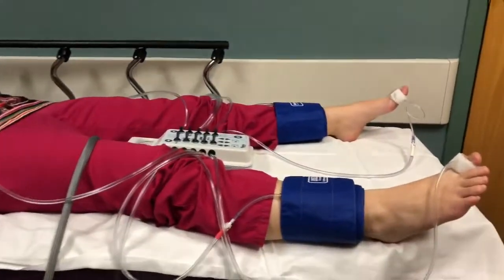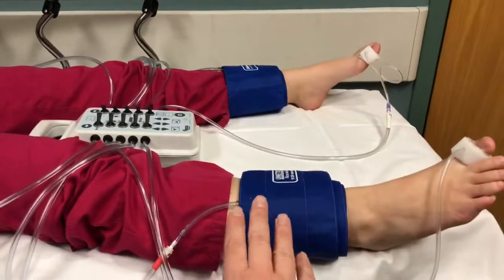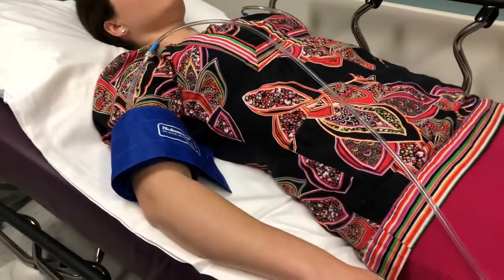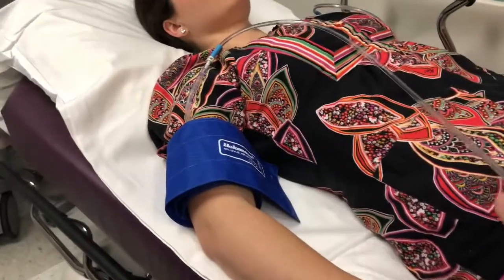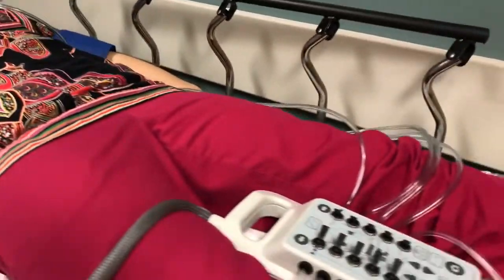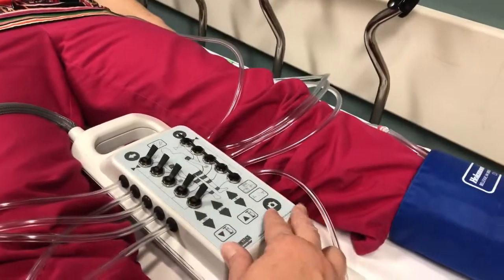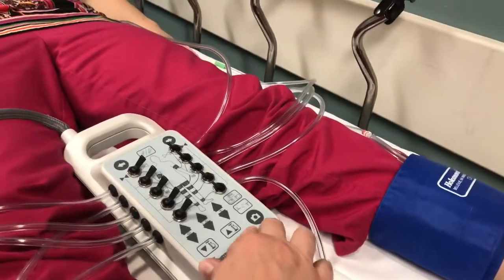Here the patient already has the cuffs on the ankles and the arms and is already hooked up to the air tubes, and all the air tubes come from this main hub.